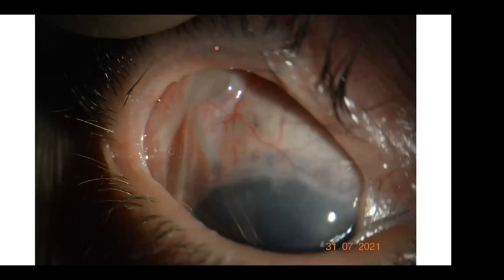So nowadays I hate those valves. When I just open the lid and I see the valve, I know this is the area where a lot of fibrous activity, a lot of scarring will happen around the implant.